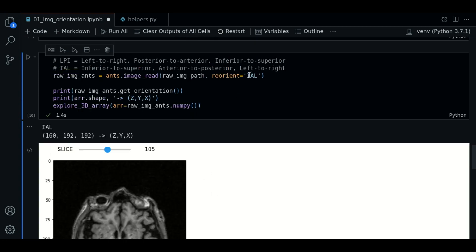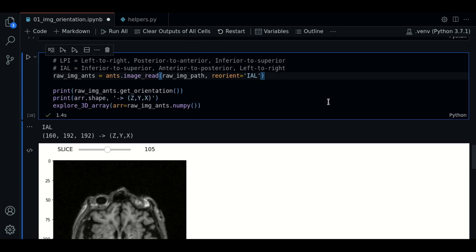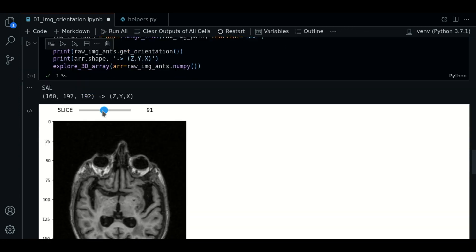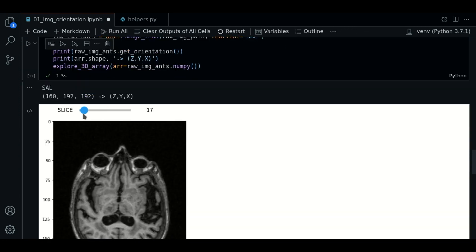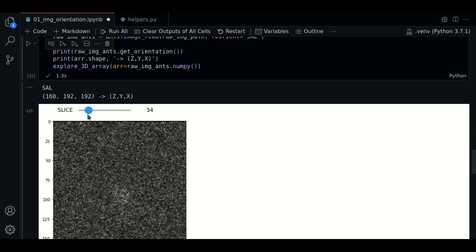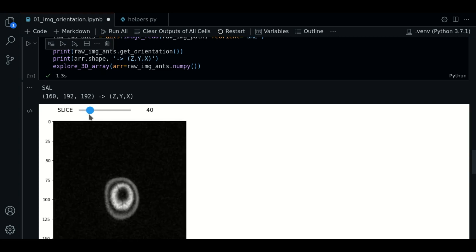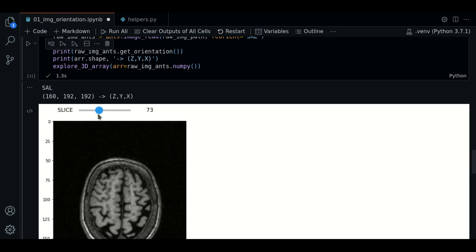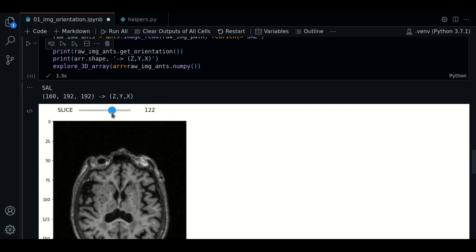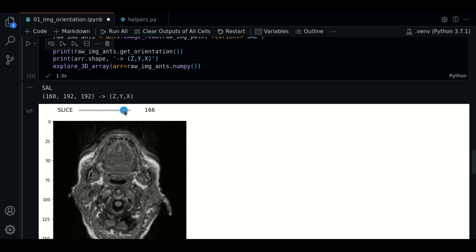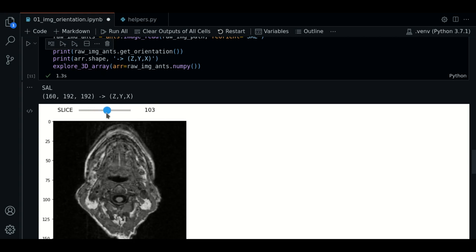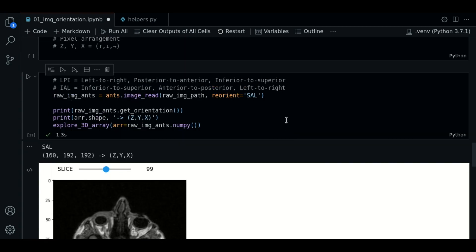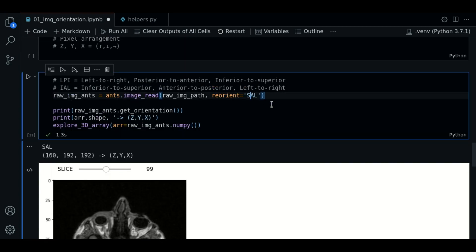We can play with changing the orientations as well. Let's change the first letter I to S for example. And now, it seems it is the same, but if we go along the first axis again, we will see that the orientation is inverted. Now, we are going from the superior side of the head to the inferior side. Let's change the string again.